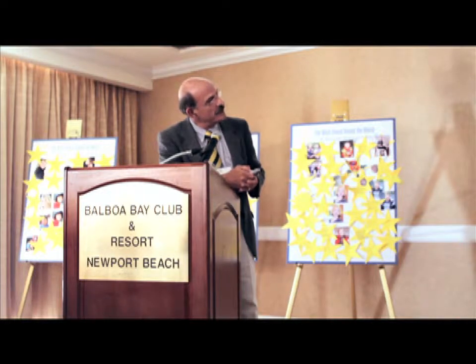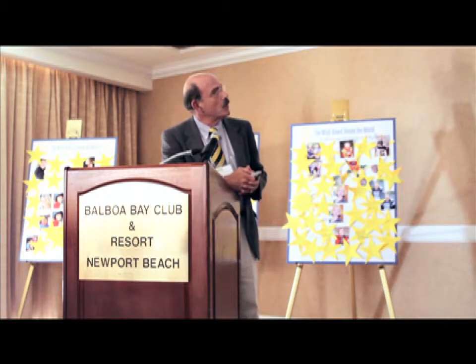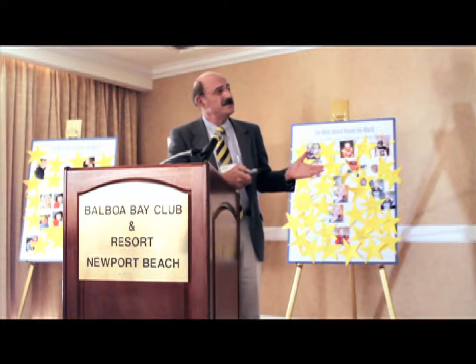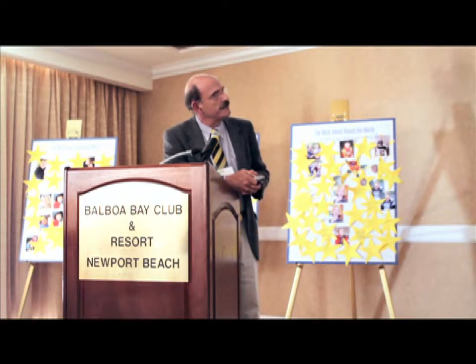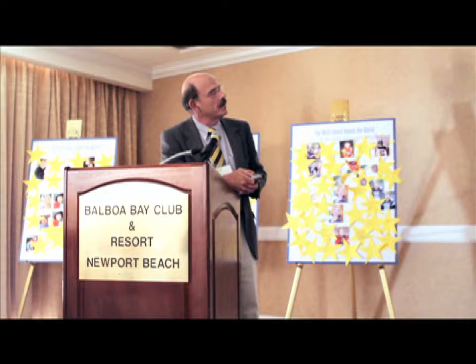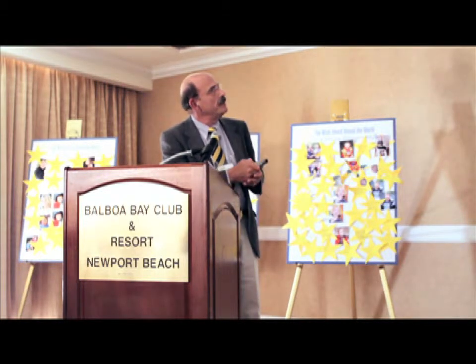Now early on in the young mouse, 3 months, we first begin to detect some cystine crystals. You can see the slight crystal right here that's within the corneal endothelium in the very back layer of the cornea. As you move on in age, these crystals then get larger and get quite prominent. They get larger than the size of a cell. You can begin to see crystals in the stroma. As you can see here, here's the next Z slice. This would be the epithelium. This is the endothelium, and we see all these crystals in the corneal stroma that develop, and this is what's scattering all the light.